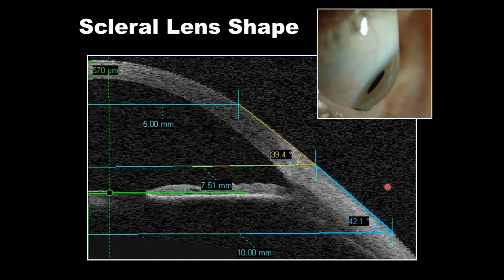So 20 millimeters across the sclera. And this straight line or tangent shape is really seen in this image. Notice how the cornea, of course, is curved, but as you reach the peripheral cornea, the limbus and the sclera, it really is like a straight line surface.